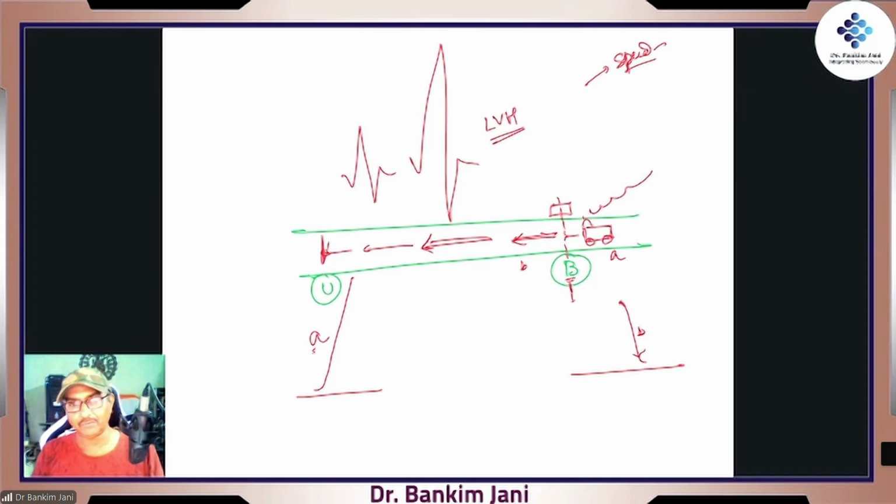So many things, yes, but I have designed a system, just a 6-step system. Any ECG comes, you just follow those 6 steps. And when we discuss the ECGs, we'll be following all 6 steps in that order. Even if it is so obvious that this is nothing but septal infarction, no, we'll not be standing like that. We'll be going step 1, step 2, step 3, step 4, step 5, step 6, so that in your brain it is set that every time you see an ECG, you follow that pattern. When you follow that pattern, you'll be able to diagnose even complex conditions. So this is clear, right?